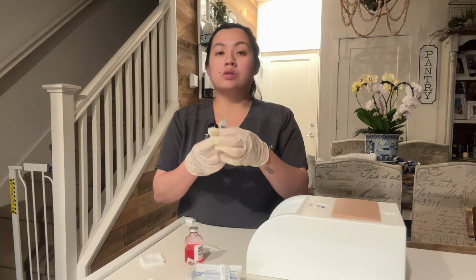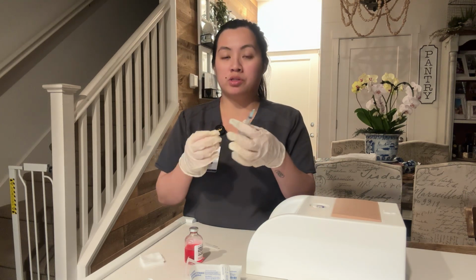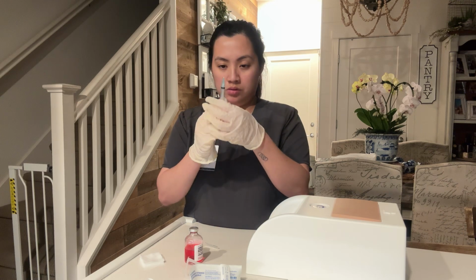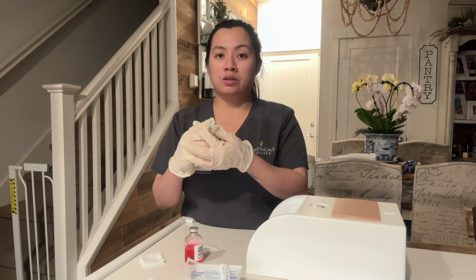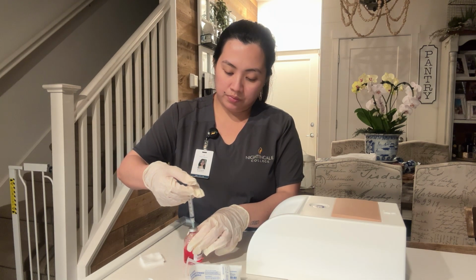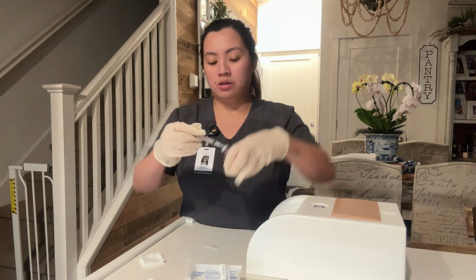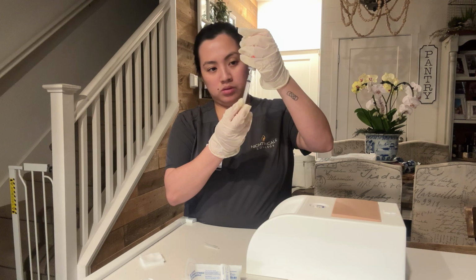Okay, so I'm going to draw air into the syringe equal to the prescribed dose. So it's just 1 ml. And then I'm going to inject the air into the vial. I'm going to invert the vial, and I'm going to withdraw the correct medication dose.